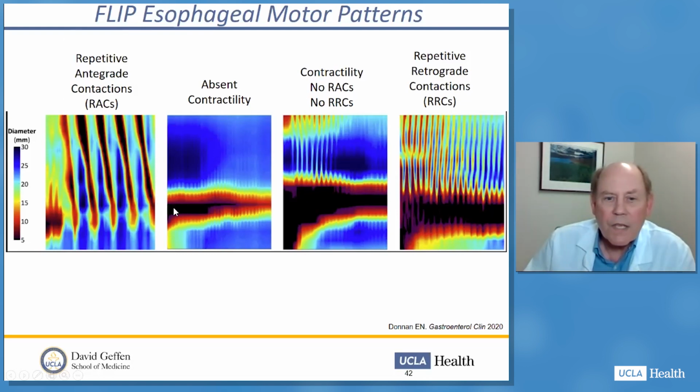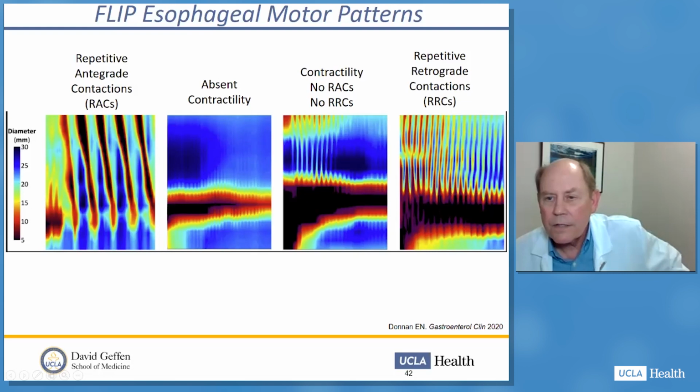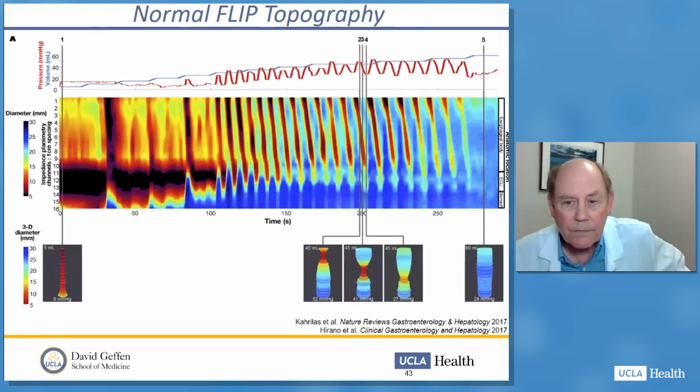This is normal. Here we have absent contractility. Nothing is happening. Here, there's just a hint that there's some contractile activity, but no real retrograde or antegrade contractile activity. And then last, here are contractions moving the wrong direction in the esophagus from the esophagogastric junction up. These are called repetitive retrograde contractions, or RRCs. So these are the players, and these are used to make diagnoses of esophageal motor abnormalities.